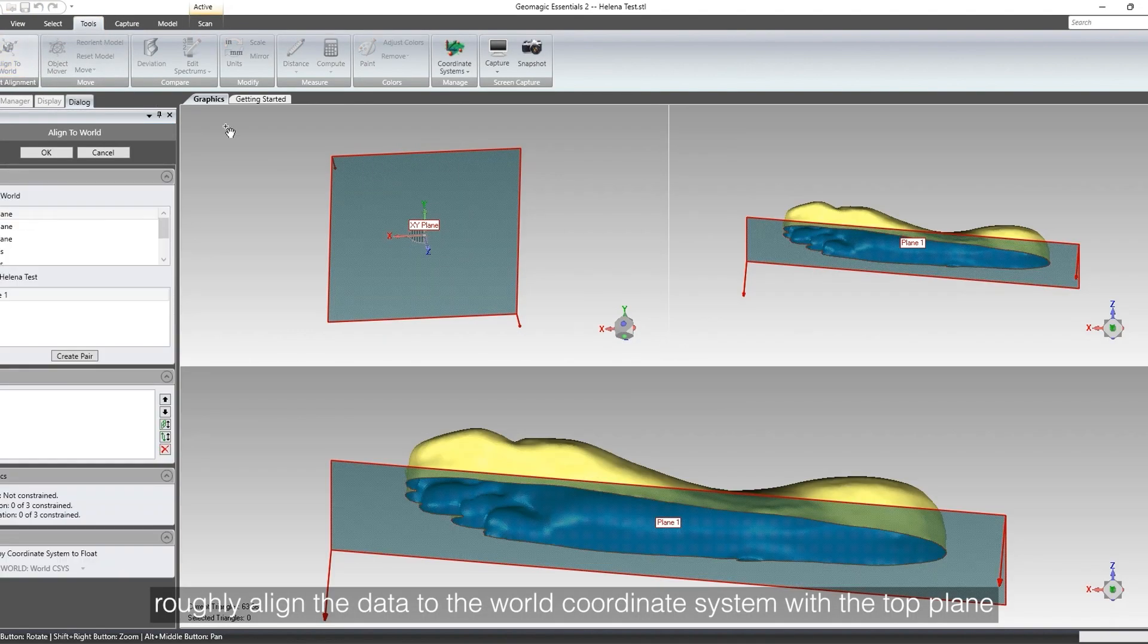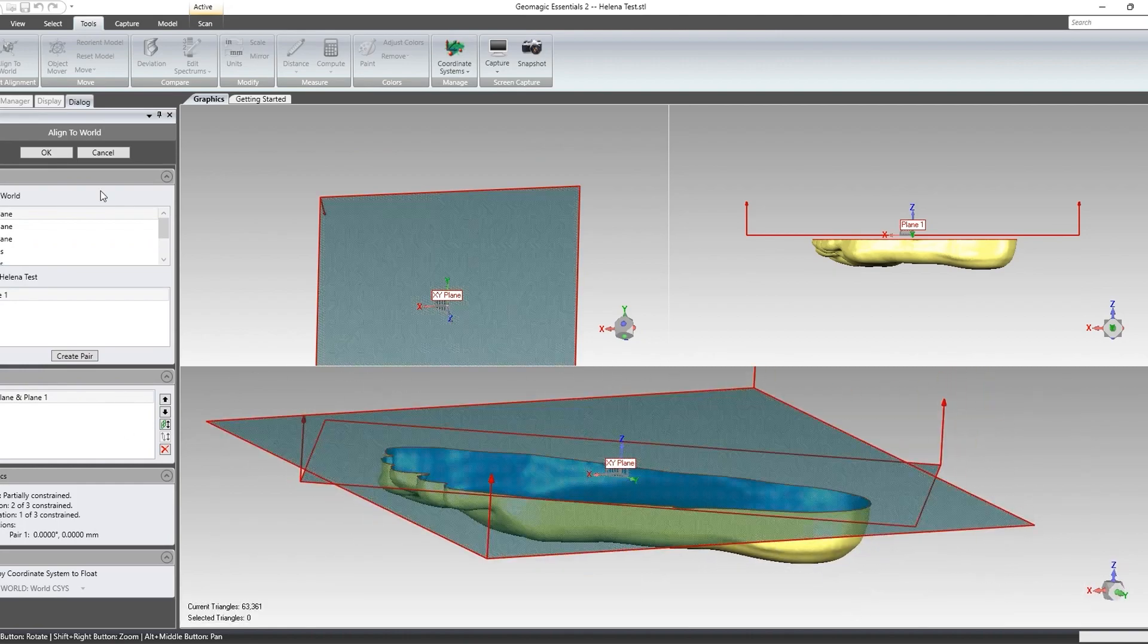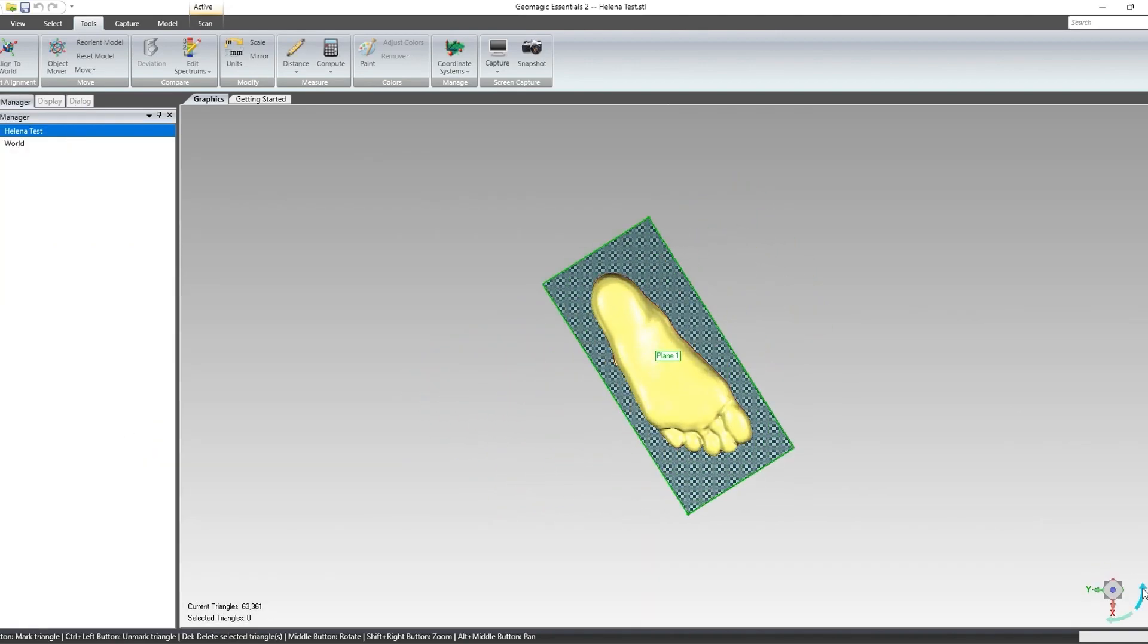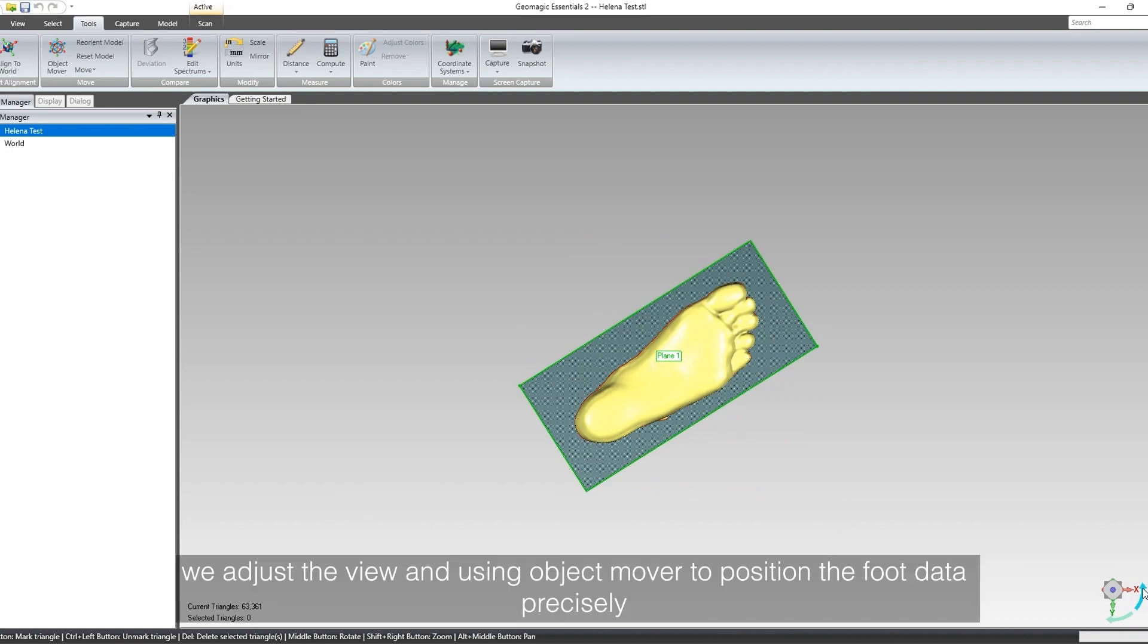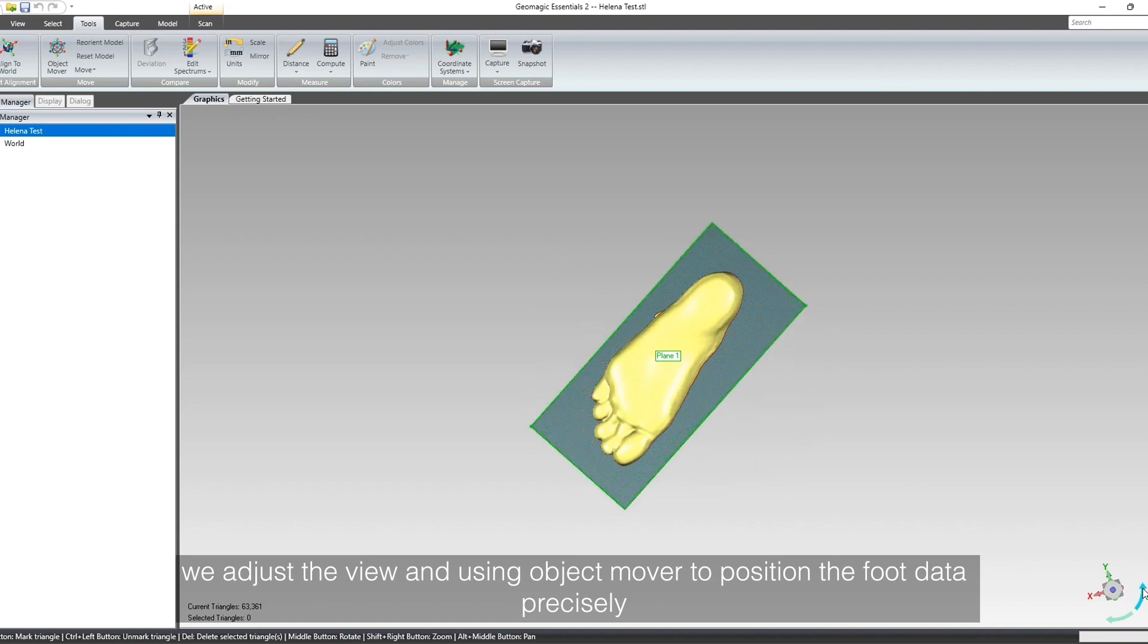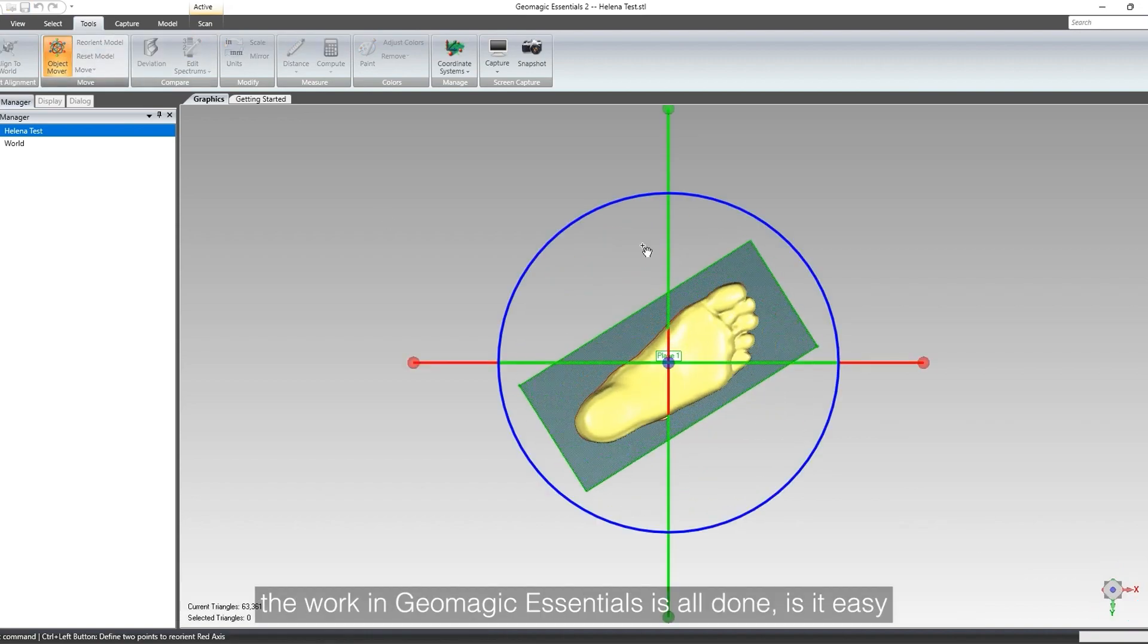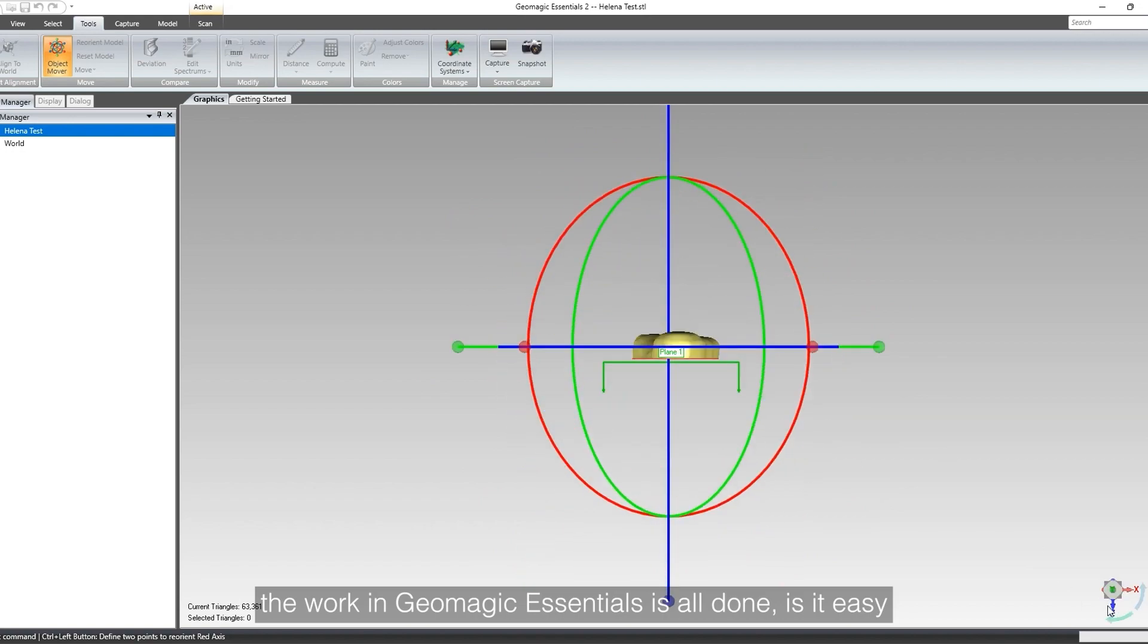Roughly align the data to the world coordinate system with the top plane. Finally, we adjust the view and use object mover to position the foot data precisely. The work in Geometric is all done. Is it easy?